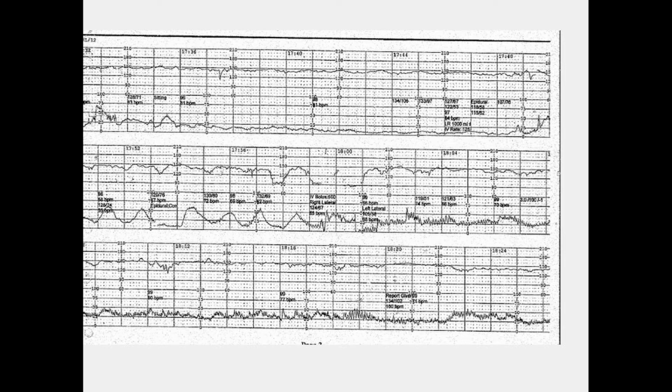What are our 3 types of fetal heart rate variability? Good. Minimal, moderate, marked. Minimal variability is a beat-to-beat change that is 0 to 5 beats or less, right? Moderate variability is a beat-to-beat change of 5 to 25, and marked variability shows variation of more than 25 beats in amplitude. Okay, so you know those definitions, but nobody answered.